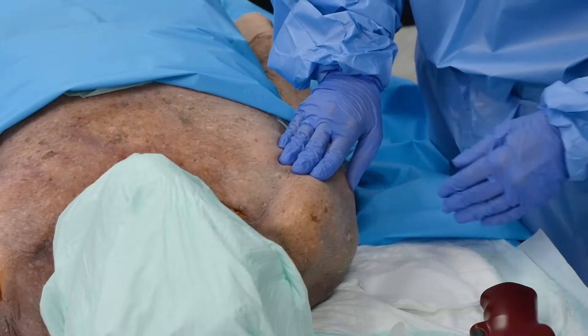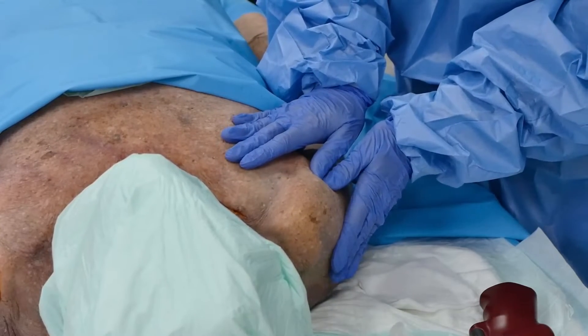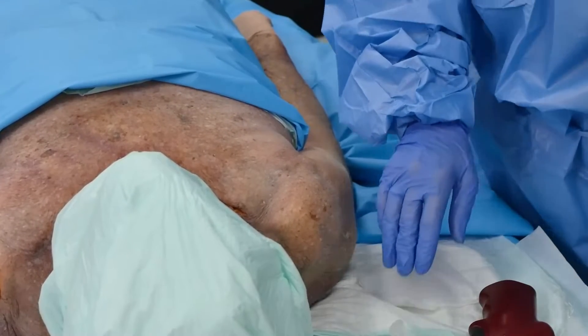Let's do a proximal humerus insertion. I've got the arm in the correct position and I've already landmarked. I've also cleansed the skin per my facility policy or protocol.